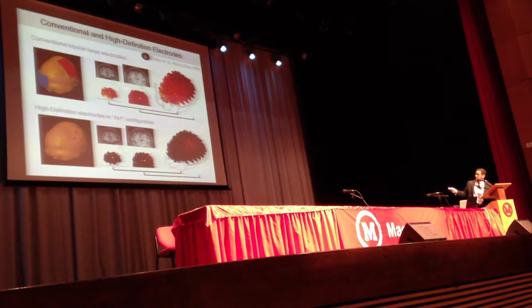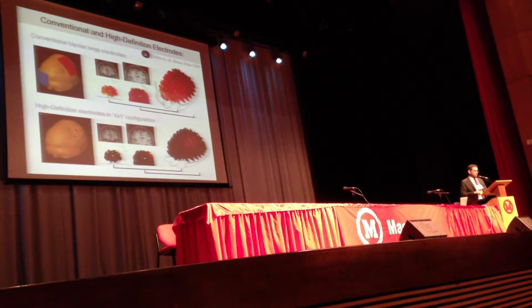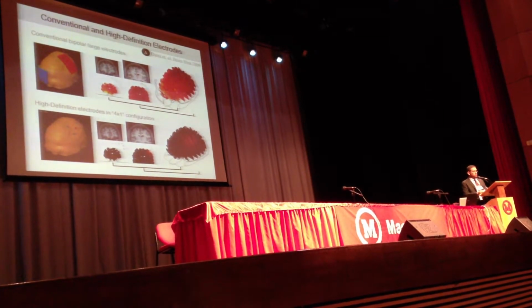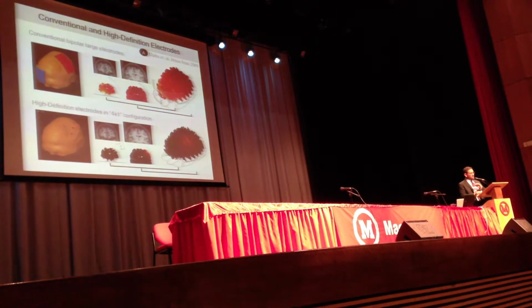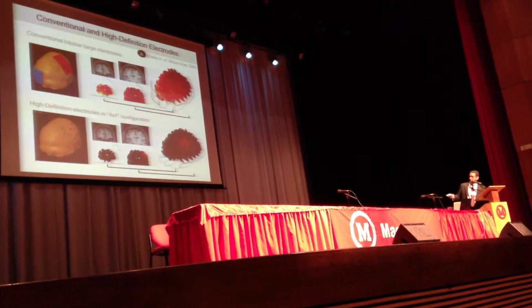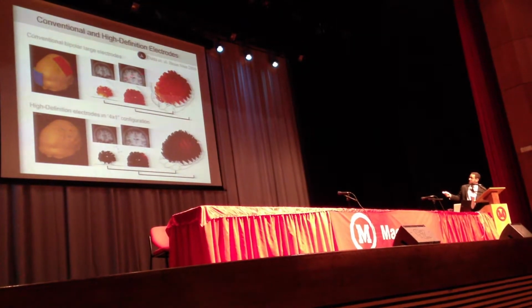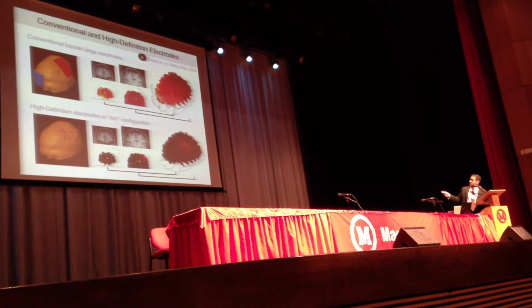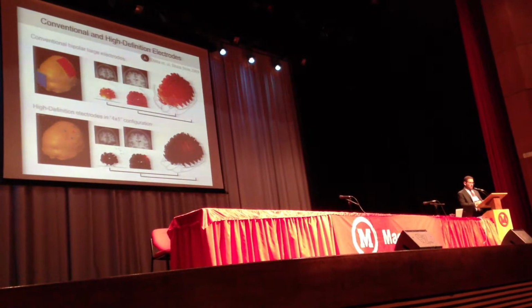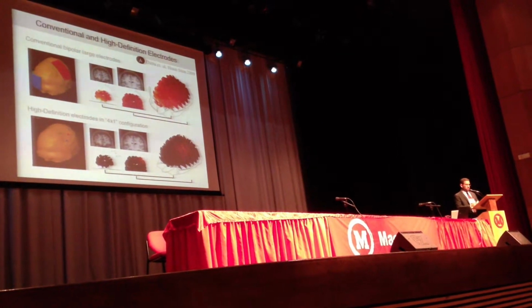You'll also see in the cross sections that it does not stay in the gray matter. It's not strictly superficial. Just like if you were to put electrodes across a watermelon, you wouldn't expect to see the current flowing just across the top of the inside of the watermelon. You'd expect the whole watermelon to fill up with current. And that's what you're seeing here in this head model. You can also see there's a lot of spread all over the head, in fact. So this montage, though it's been very successful, can produce, according to the models, some rather diffuse current flow.